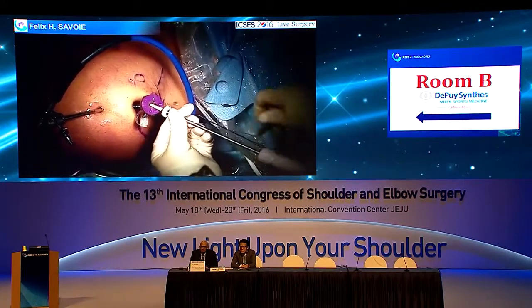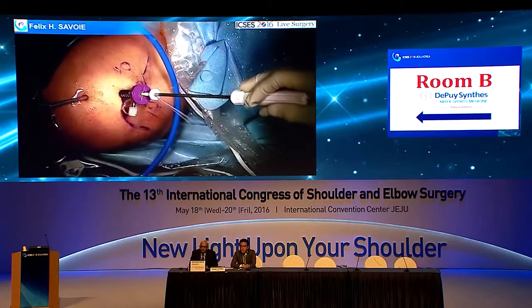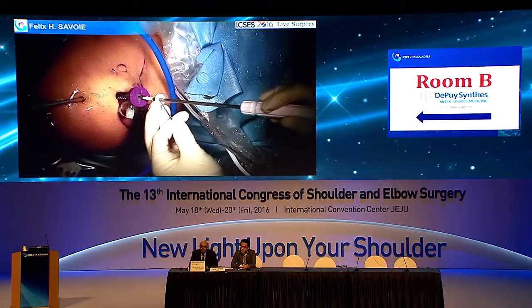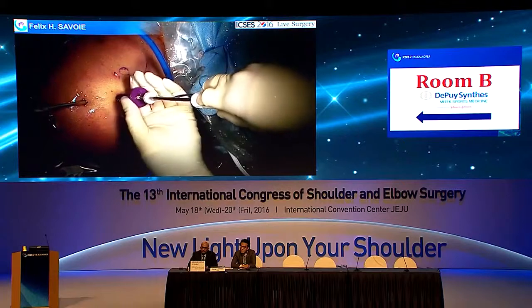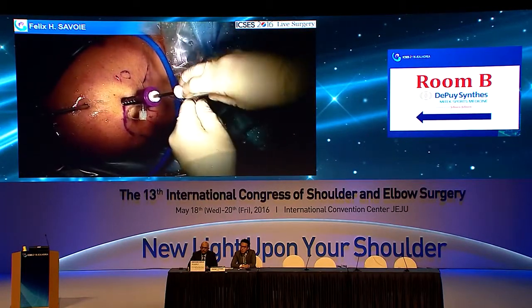Okay, so now we have all 4 stitches coming out of here. The little white disc is, you can kind of dock your sutures and separate them if you want, so that it's not a problem. Now we'll just slide. This is going to stay on the outside, and so what we'll do is we'll just slide right down our stitches, so you see them all coming in.